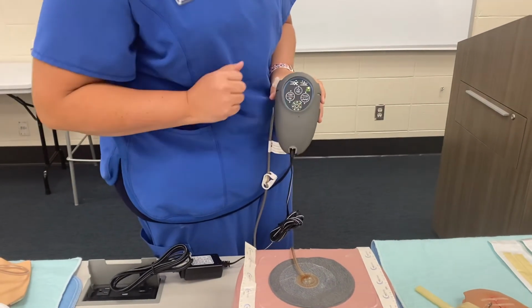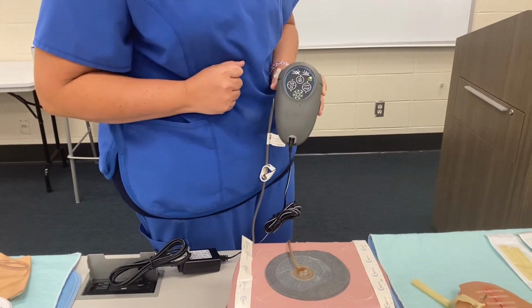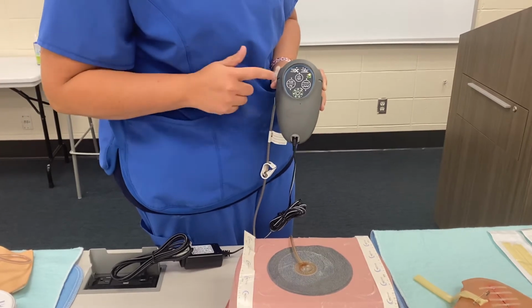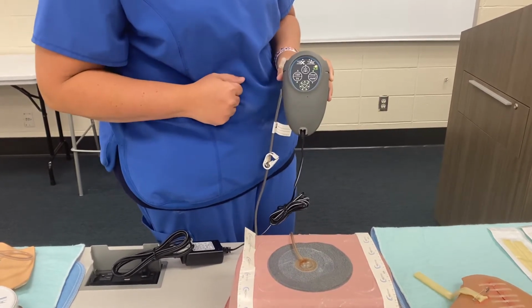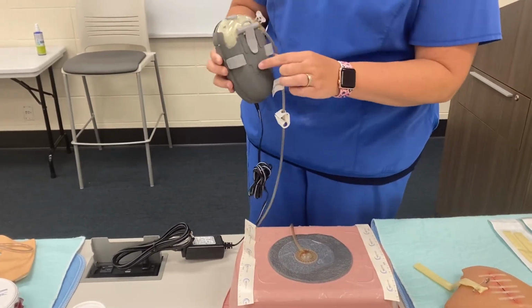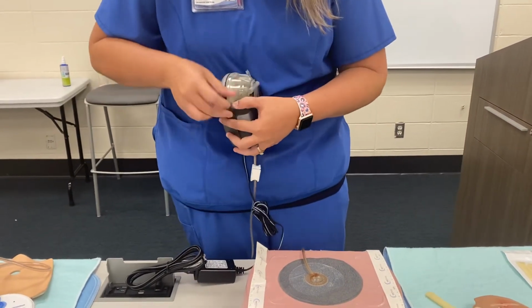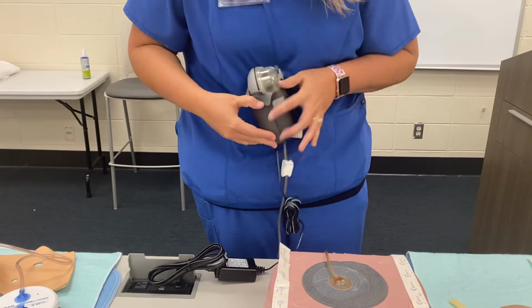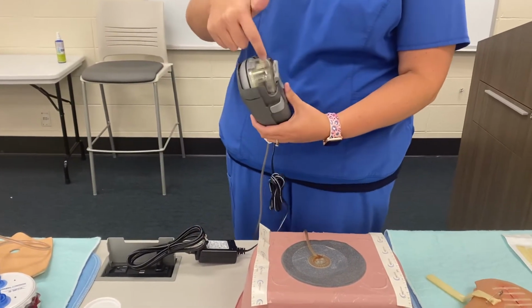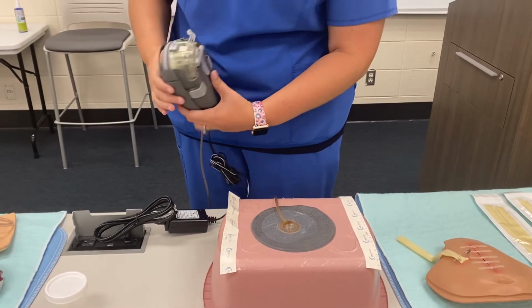So the patient just simply turns it on, and the doctor would give them orders. Does it need to be 125 millimeters of mercury suction or 75 millimeters of mercury suction? This one is set on 75, so you see it's lit up, okay? And then on the back of it, you have your drainage container. So again, this is a home one, so it's not easy to measure the output. It is on the side where you can see, I don't want to break it down, but you can see there's measurements, okay? The ones in the hospital are a little bit bigger, and it's easier to see the measuring container for us to record our patient's output.